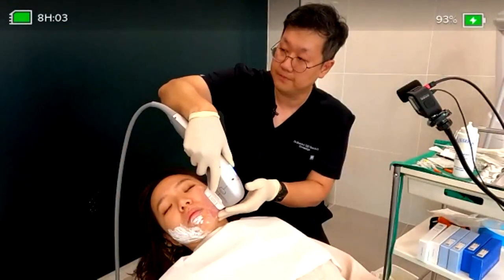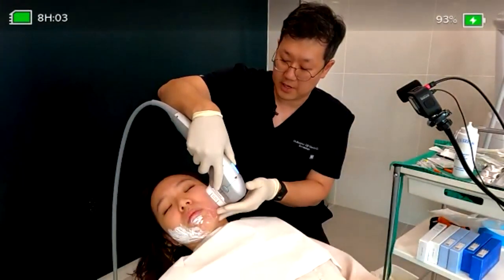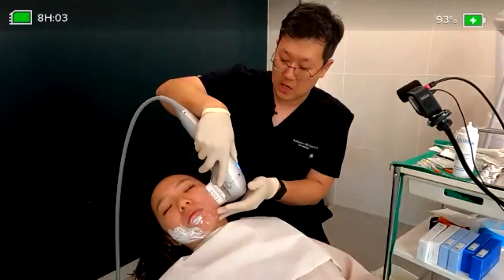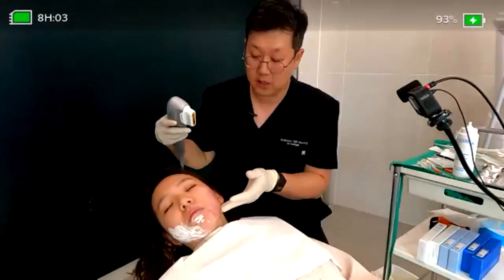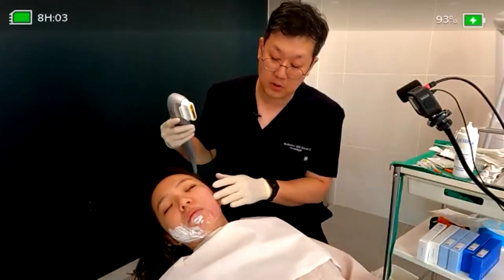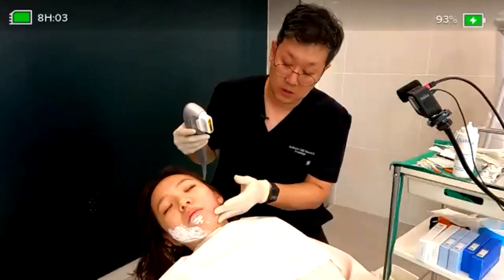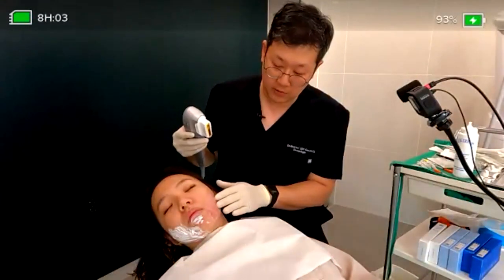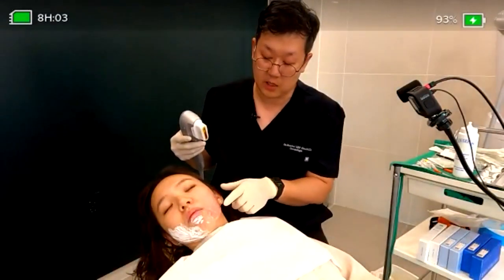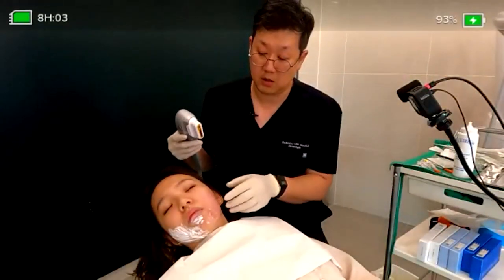And now we are approaching separate shots already. I will go one by one and side by side quickly. So you can see some of the redness coming on, but usually it happens with just a temporary swelling on that. And the second tip of today is if she has some of the complaints, like my cheek is so chubby or something, we can just fix them.